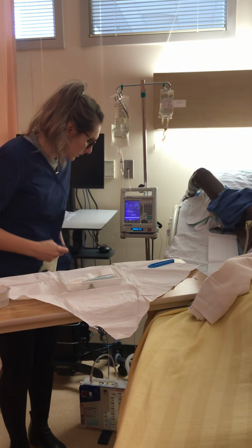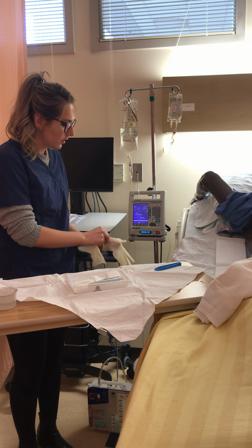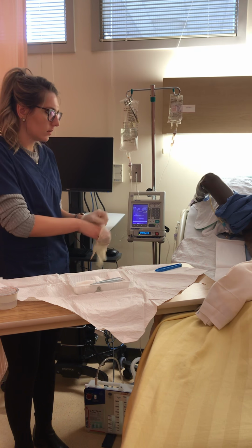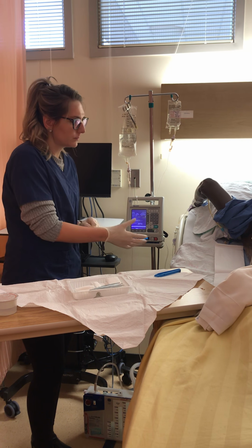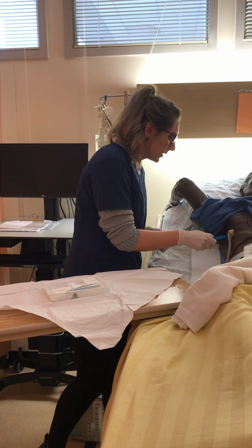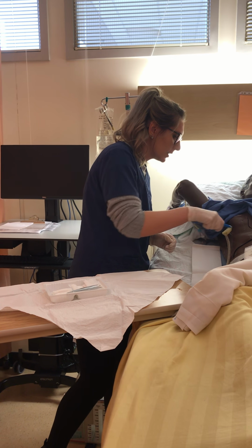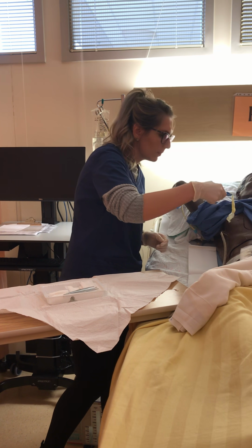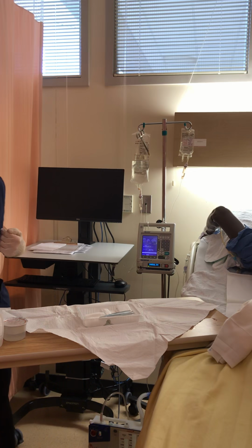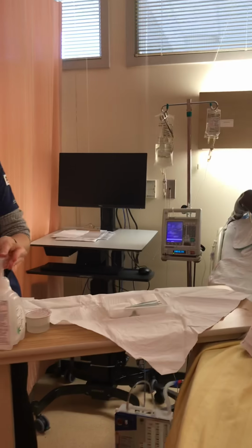I'll clean that up in just a second here. Okay. So I will deal with this afterwards. So I'm going to take this, and I'm just going to remove the Jelonet here. Be very careful to not dislodge the tube. The tube is stitched in on a real patient. So now I'm just going to dispose of this over here. Bubbles are still there. I'm going to remove my gloves and I'm going to perform hand hygiene.